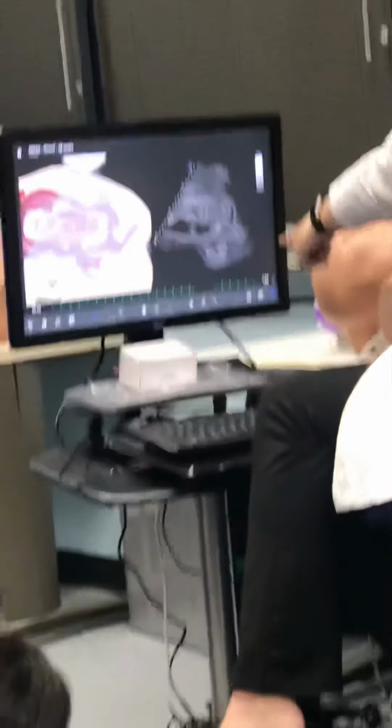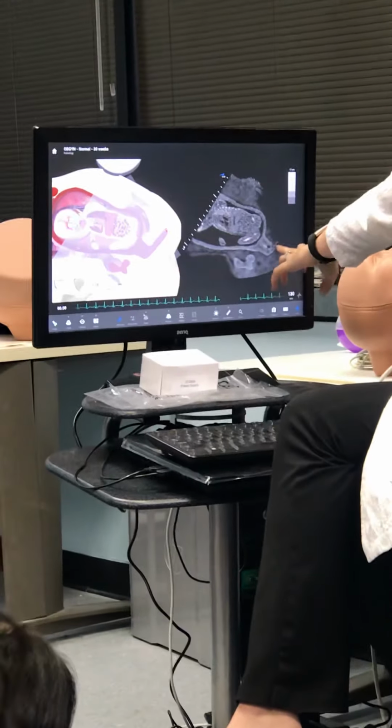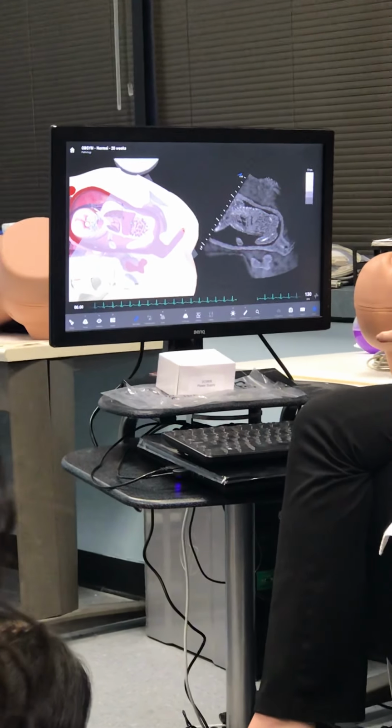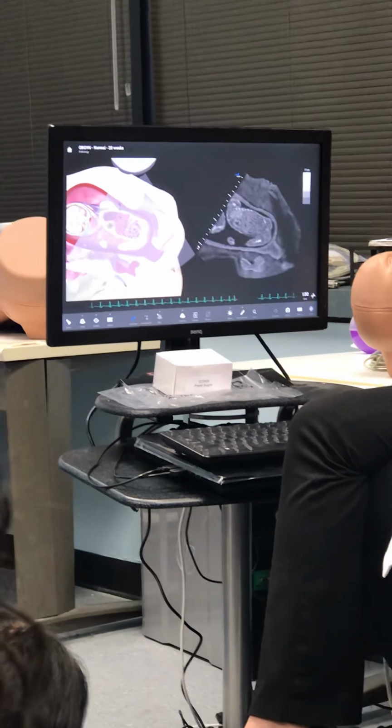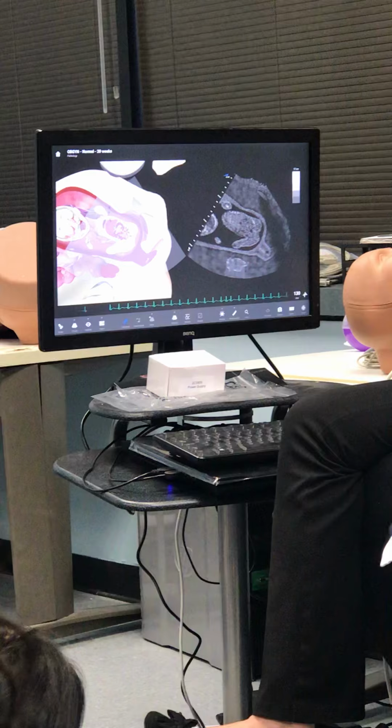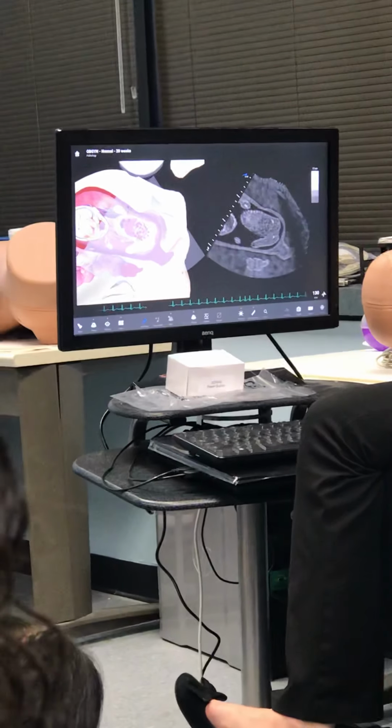All right, as far as your protocol picture goes, we're wanting to see, since this can show you vaginal canal. This thing is so cool. We want vagina, cervix. We want baby as long as we can open it. Okay. So that is our presentation picture. We're showing cervix, we're showing what's next to cervix, we're opening up baby as best as we can.